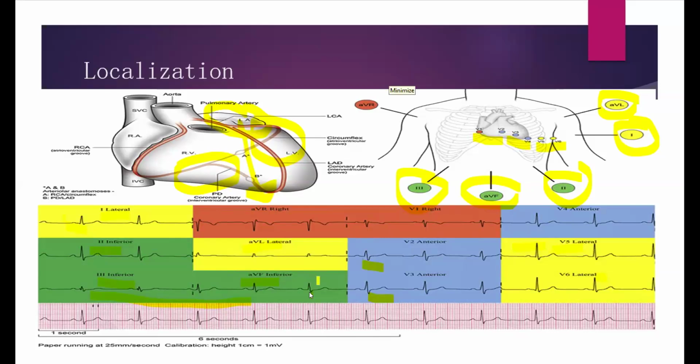I also see another question. Somebody is asking, how do you recognize the rate of sinus tachycardia? The rate of sinus tachycardia, since it's a sinus rhythm, you'll use the normal rate.